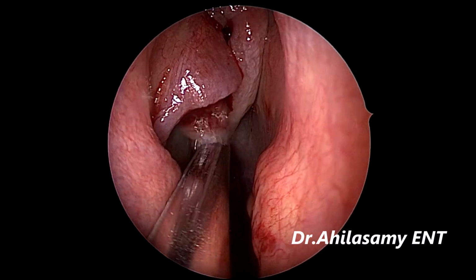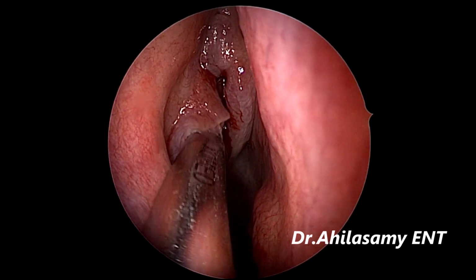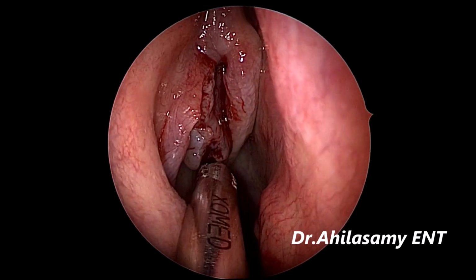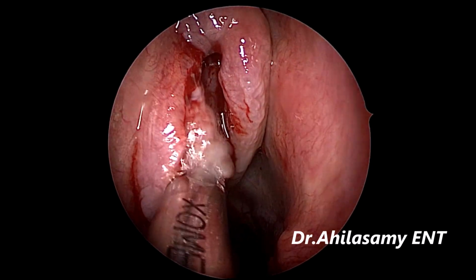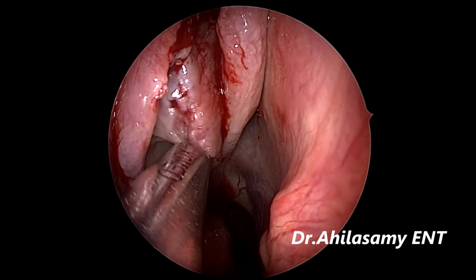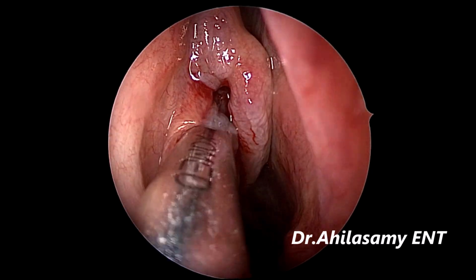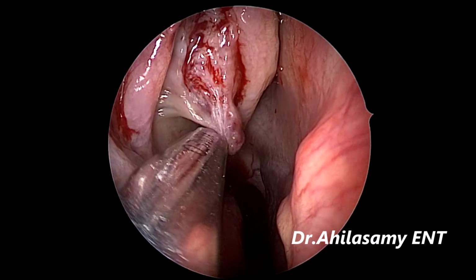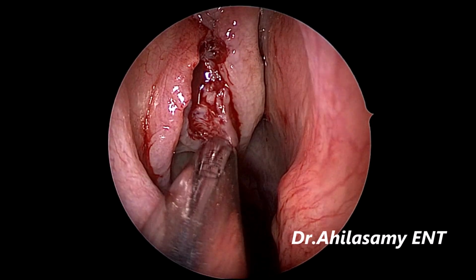With the shaver, I am taking out the polyps to get the anatomy of the normal structures. So the first step is to shave the polyps and get a normal anatomy, then do a FESS. Remember, done under local anesthesia, hardly any bleeding. We don't give any hypotensive drugs. That's the beauty of doing under local anesthesia.